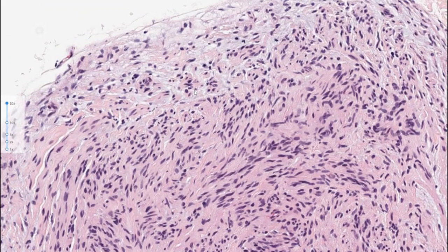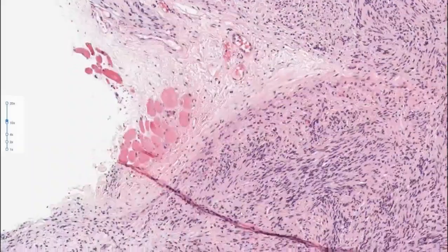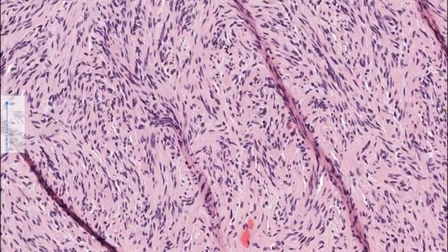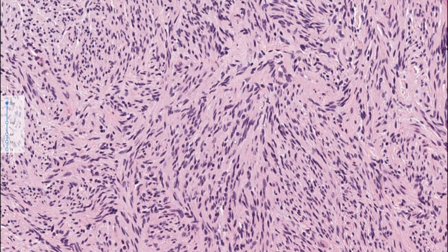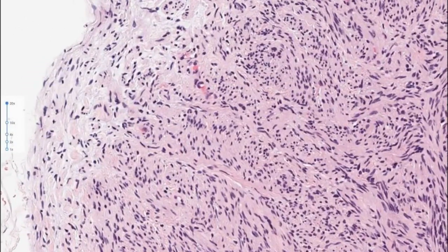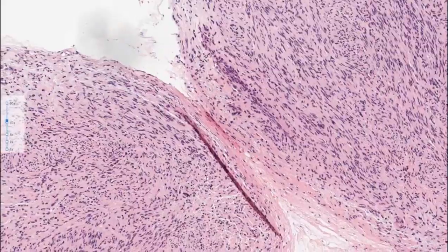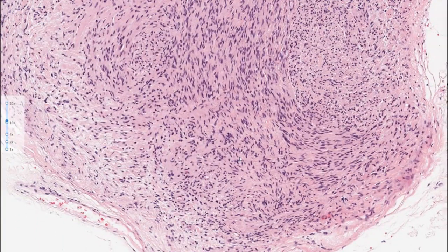Except that you start seeing things here that look more like mini fascicles. So when you look at this lesion, it looks like a schwannoma, but it looks slightly funny. Smaller little bundles. Areas that remind you a little bit more of a neuroma also. So those are some of the clues of what you're dealing with. And here, actually, stains can be helpful.